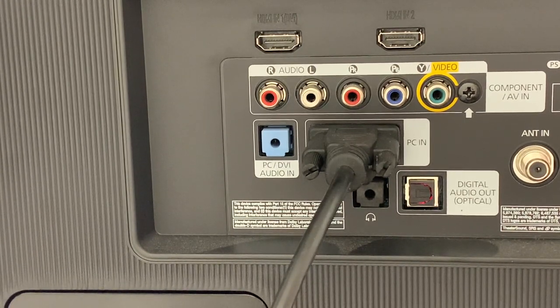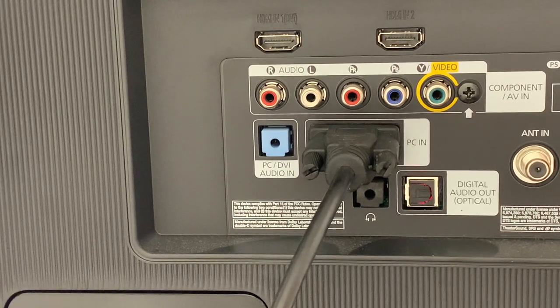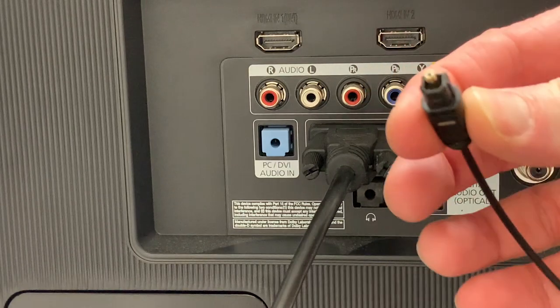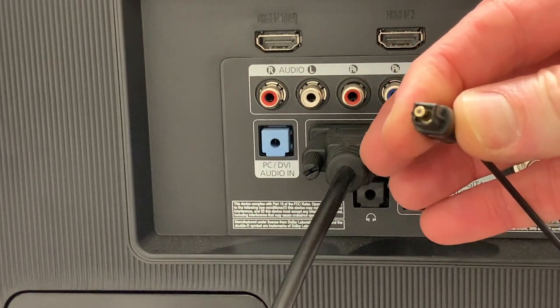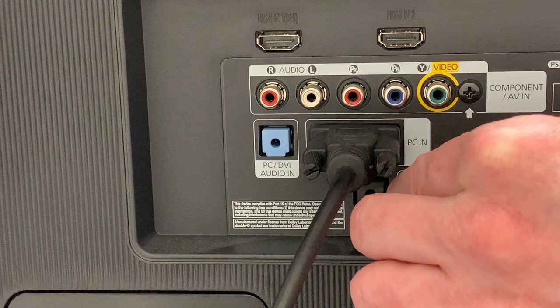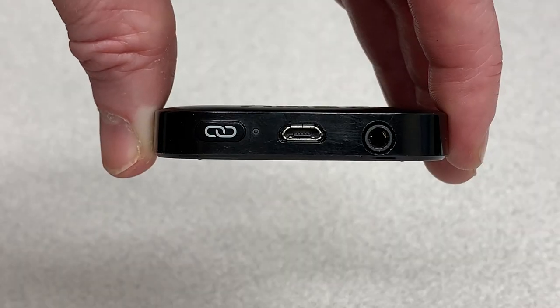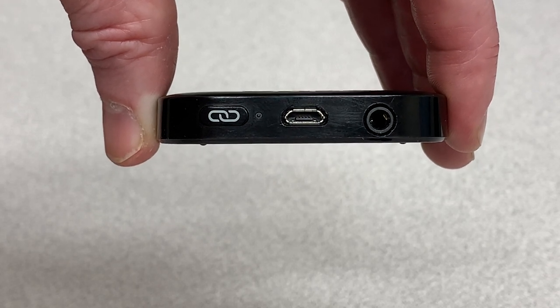The end of the fiber optic cable that has the semi-square connection is the end that's going to plug into that port. We're just going to go ahead and plug this in — you feel a little snap as you plug it in. The other end of that optical audio cable will go into the right side port on the TV connector.